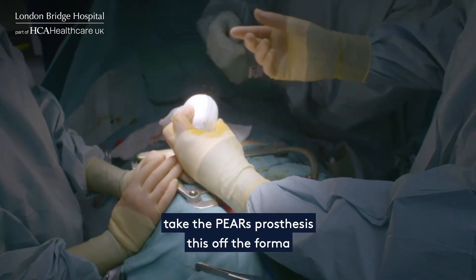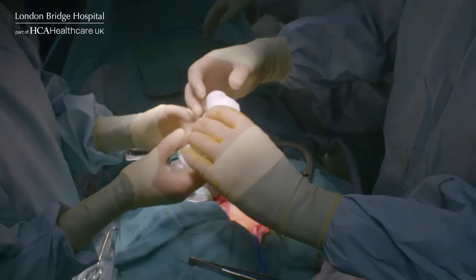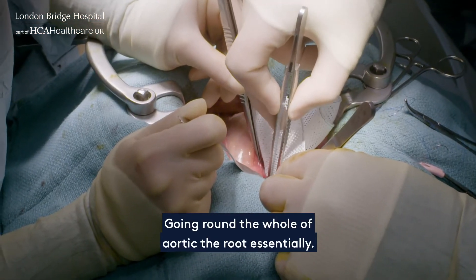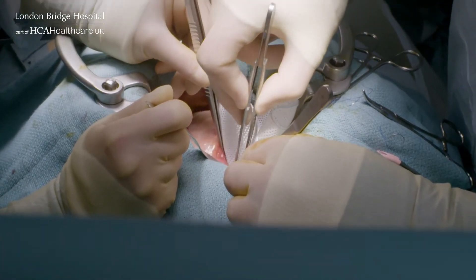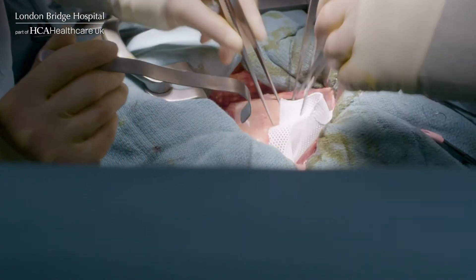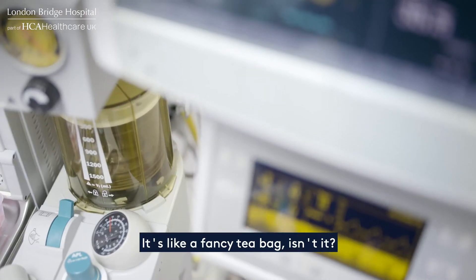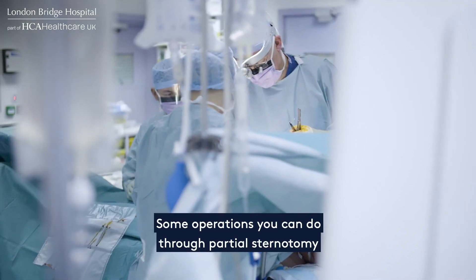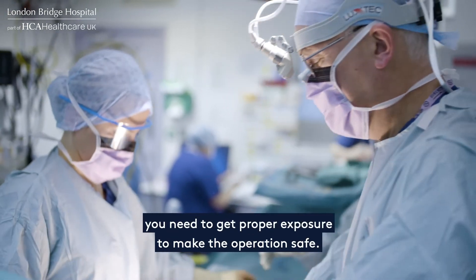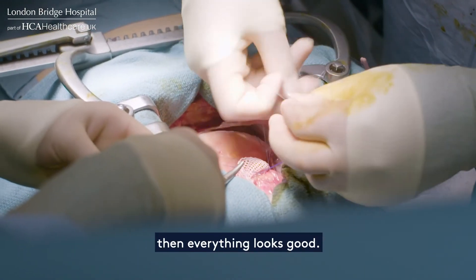Now we have to take the PEARS prosthesis off the former, going around the whole of the aortic root essentially. Slip that through — it's like a fancy tea bag. Some operations you can do through partial sternotomies, only opening up a little bit of the breastbone, but this one is a big operation. You need proper exposure to make the operation safe. These are important stitches — once you get these right, everything looks good.